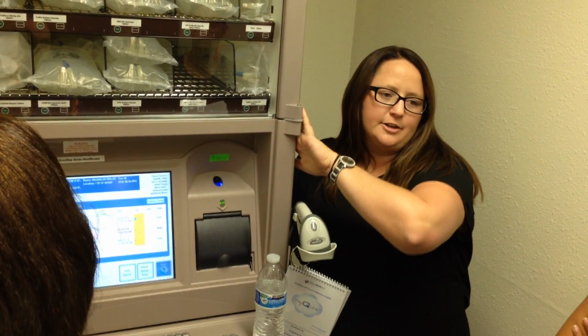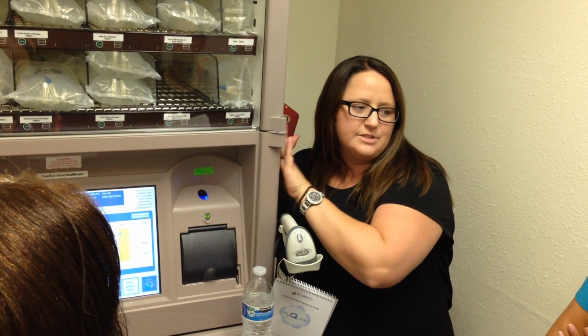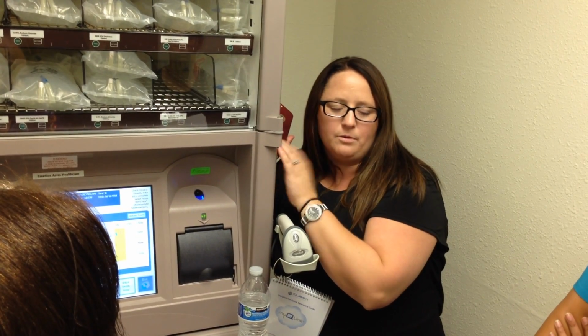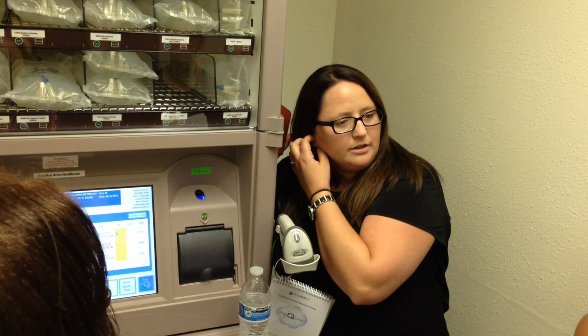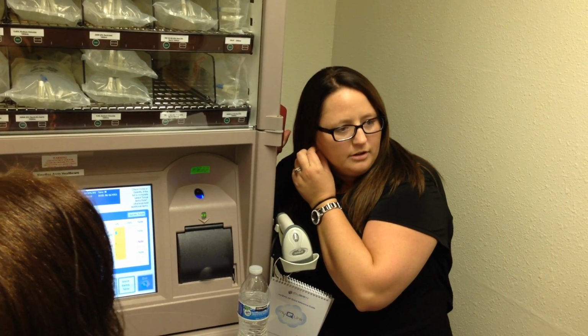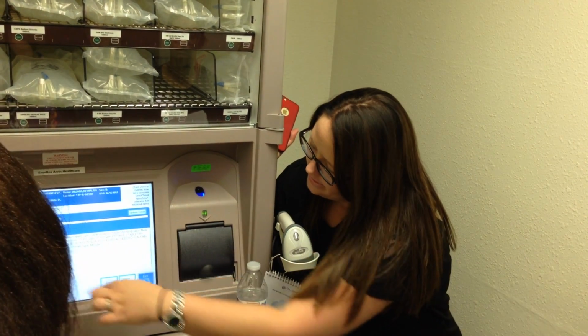Once an item comes out of here, it does not go back. There's a no return policy, okay? All of this stuff is owned by the pharmacy. This is our inventory. This belongs to us. It becomes your property as soon as you take it out, okay? So as soon as you tell me you're taking 2 Norco out for a patient, those Norco belong to the facility now, okay?